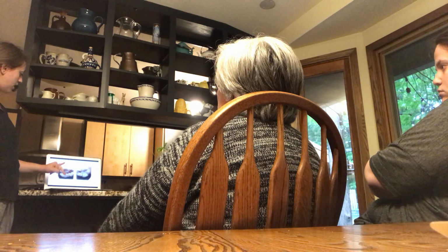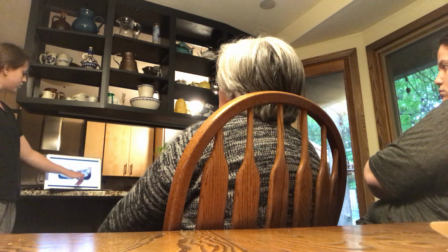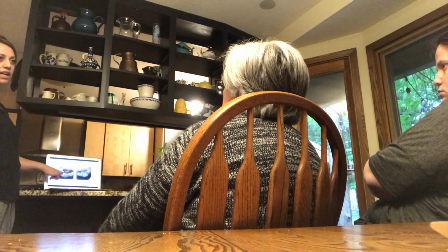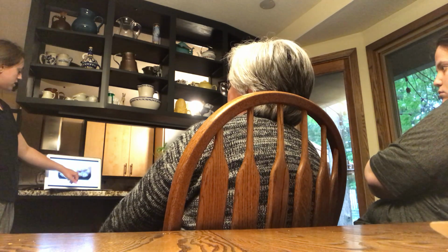So you can see here how I have a before and after picture. Before, it's kind of like a chalky white appearance, and after, it's more of a shiny appearance. Before here, this is kind of what it looks like when an etchant material is applied and rinsed off. It's chalky white, and that's when it's more susceptible. Afterwards, it's going to look like this.